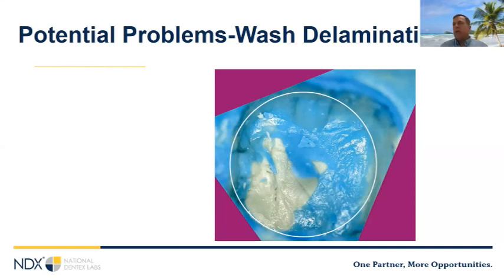If you have to do this technique for whatever reason, you could bore holes through the material to give pressure relief, but I would not use that method routinely. I've seen a few situations where labs can compensate for it, but it usually involves more blockout or whatever. It doesn't seem to give us the accuracy that we want. If you see this problem, for sure, we retake the impression because the whole impression is bad.